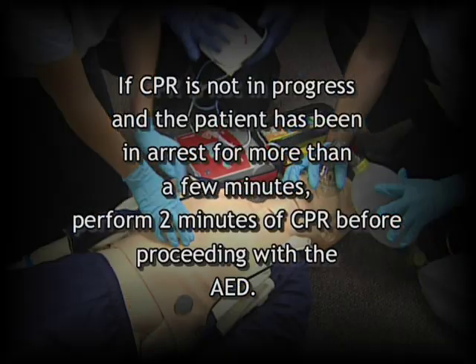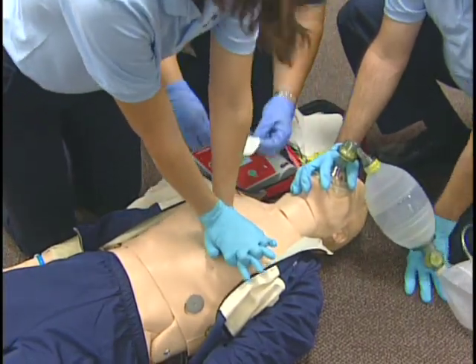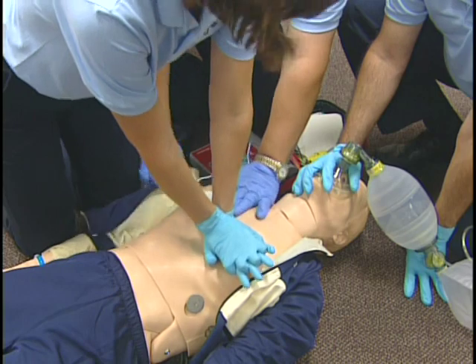If CPR is not in progress and the patient has been in arrest for more than a few minutes, perform 2 minutes of CPR before proceeding with the AED. Turn on the AED. If the unit has a tape recorder, turn it on. Attach the device to the patient.